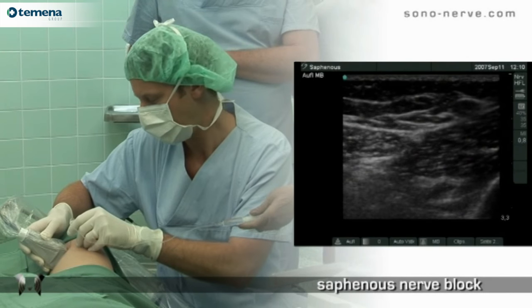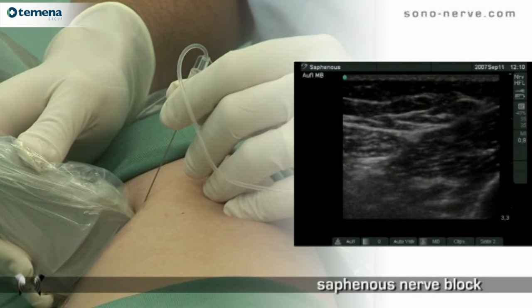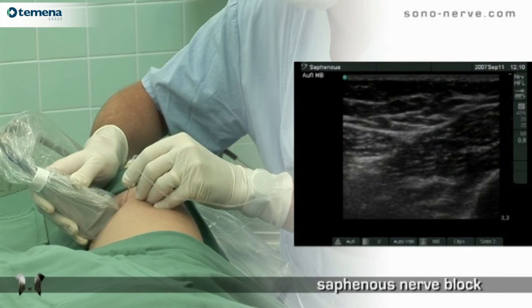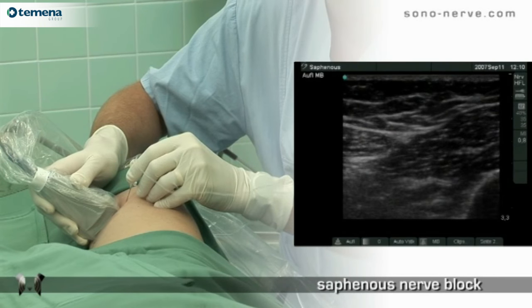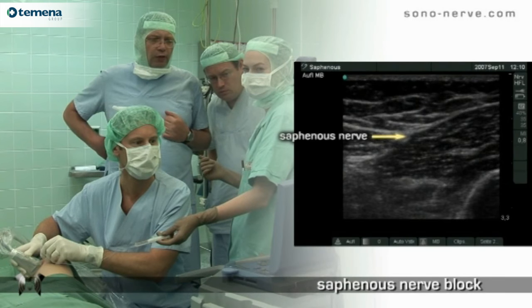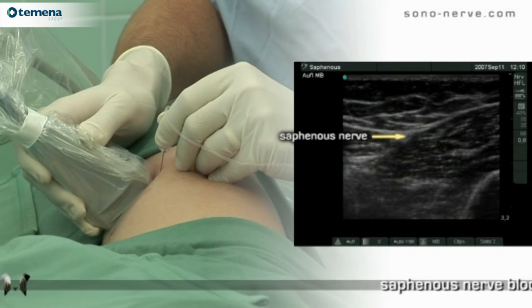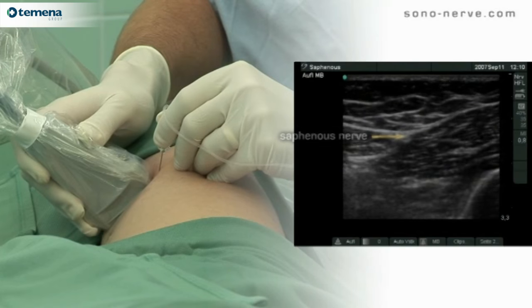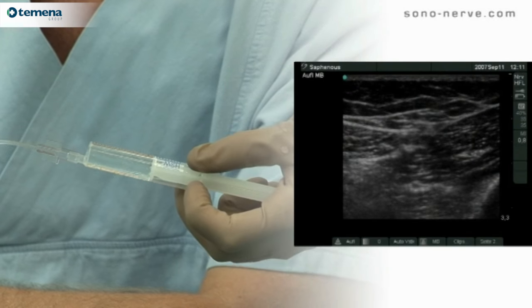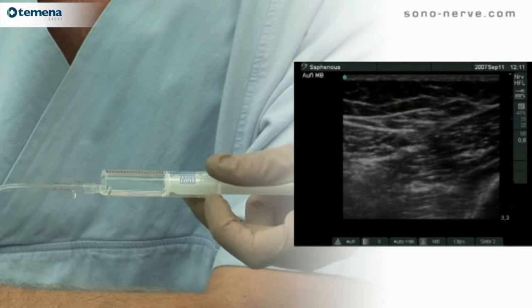For the saphenous nerve block we use an in-plane approach. The needle passes along the quadriceps muscle towards the saphenous nerve. Once it is close to it, local anesthetic is injected and surrounds the saphenous nerve.